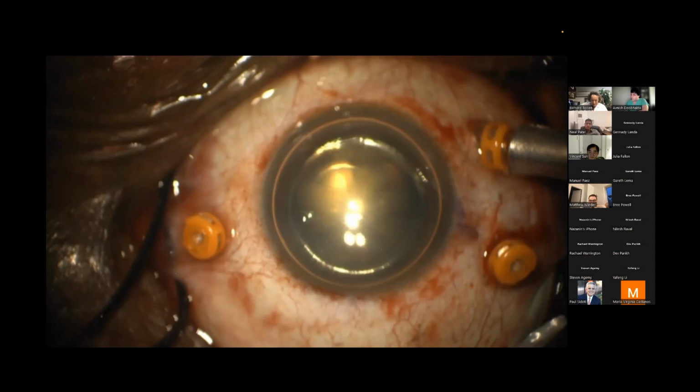But let's say the patient has a trauma, and before you don't see any phacodonesis, everything looks okay. You plan to do standard retina surgery, and then you see the lens is actually moving, tilted, the iris diaphragm is very mobile, and you were not prepared to do cataract surgery.